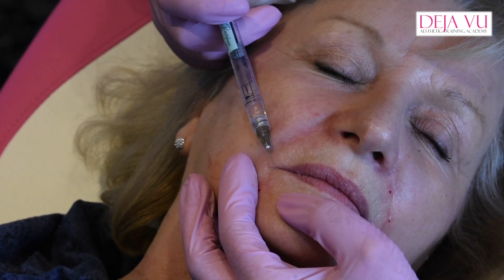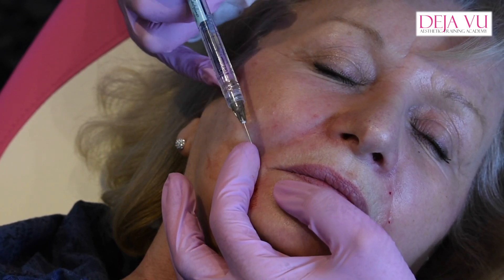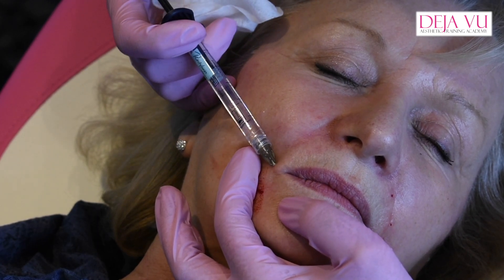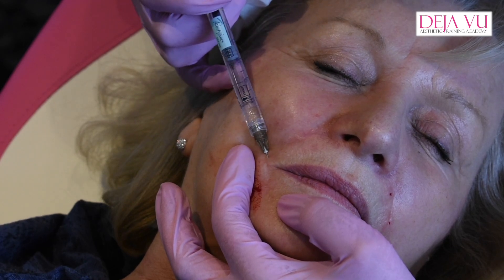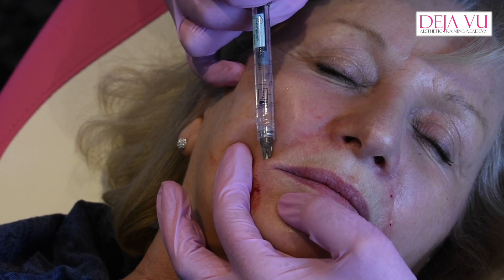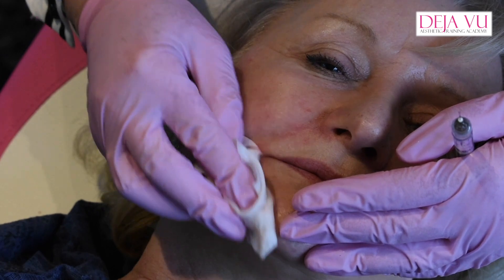What I'm going to do then, I'm going to come from this angle and I'm going to cross-section it now. I'm going to support it. So I'm going in from there, almost along the lip line, and I'm going to fan it again. So that's really giving it the support that it needs.